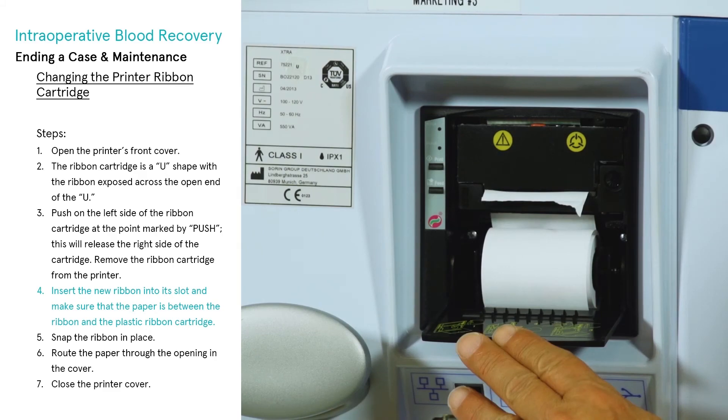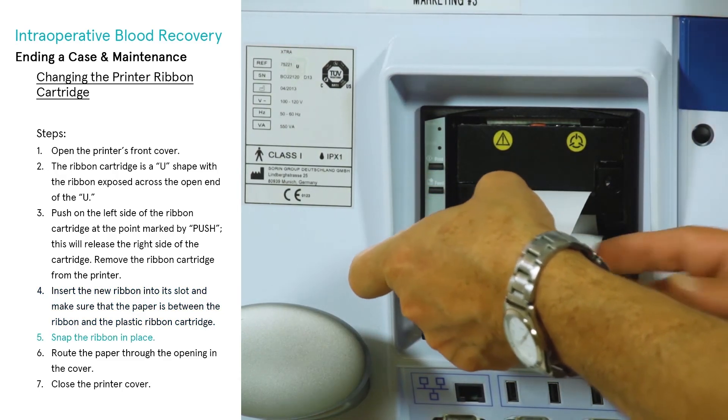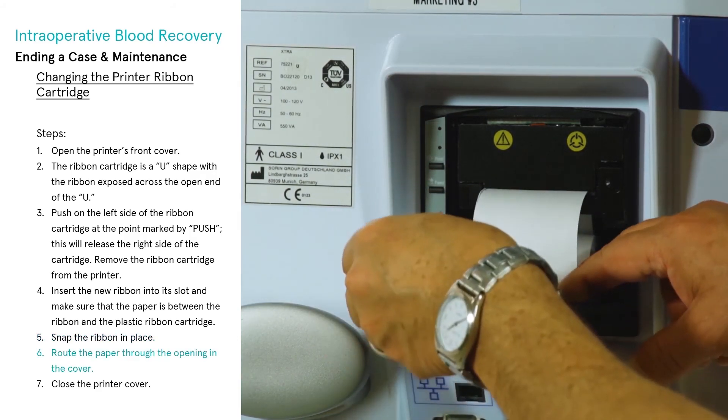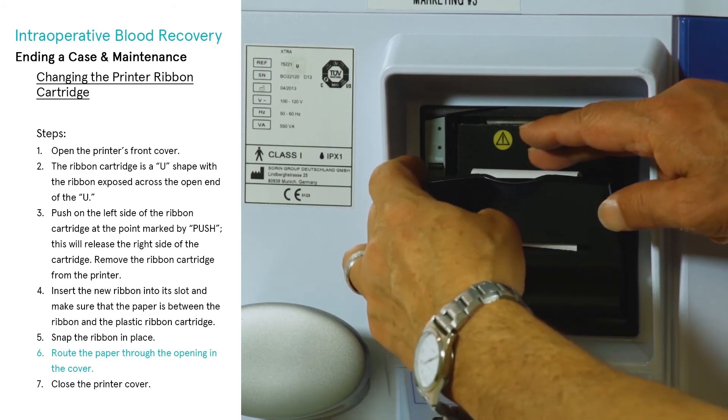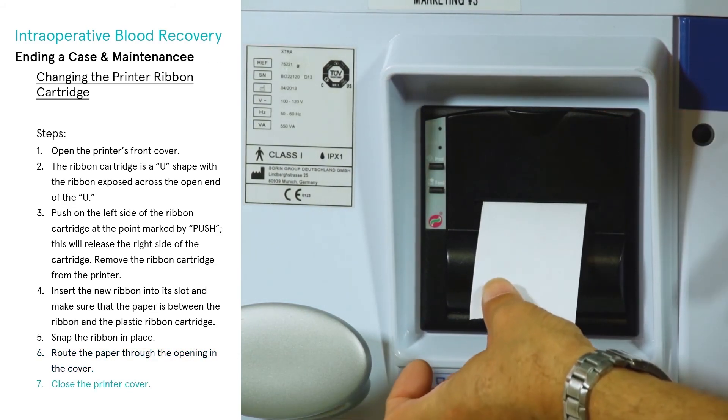Note: if necessary, press the feed button to feed the paper forward. Snap the ribbon in place. Route the paper through the opening in the cover. Finally, close the printer cover.